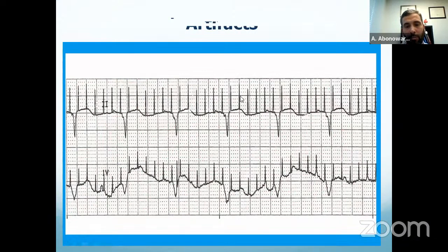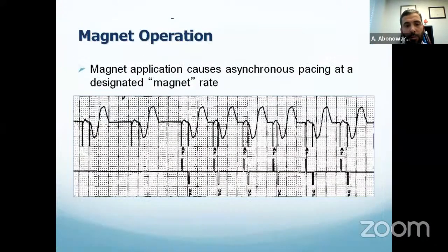Like this one also, sometimes there's interference causing artifacts like this. I have seen this several times. Again, it's not a problem. Just repeat the ECG, and make sure the patient is not moving and there's no other interference.